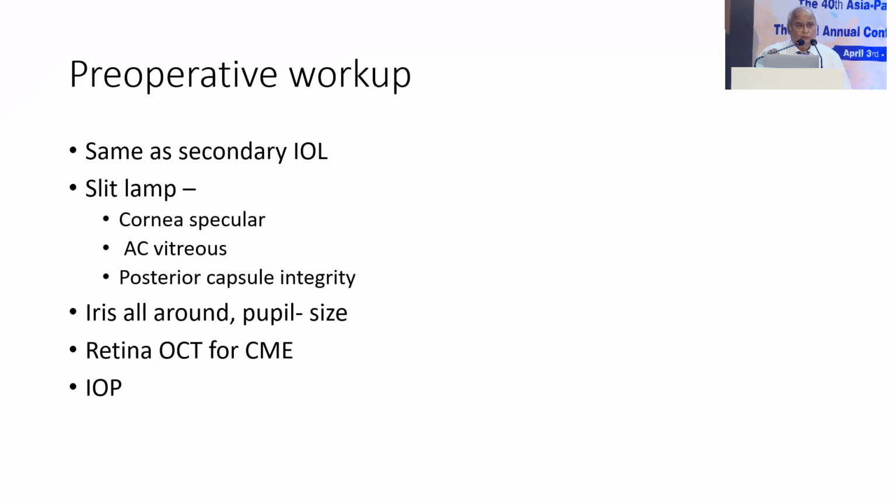So whenever you have a complication, please stop there. Give a chance to the vitreoretinal surgeon. Still we have this lens drop or nucleus drop. I go to RIO many times. Now my son is also a vitreoretinal surgeon, so many times he can handle the things. So you don't go deep into the vitreous.